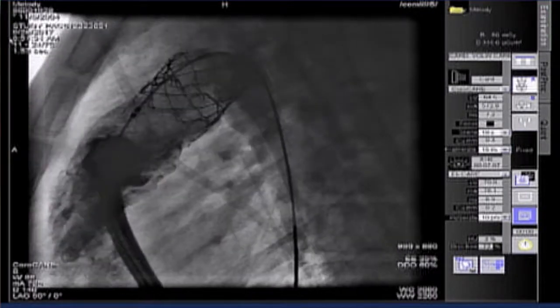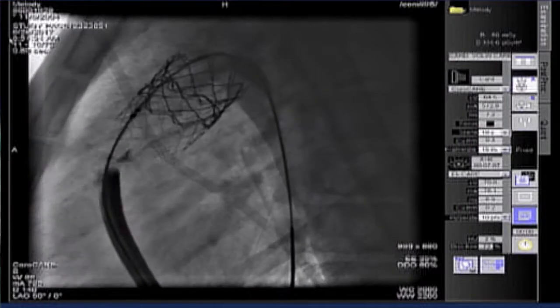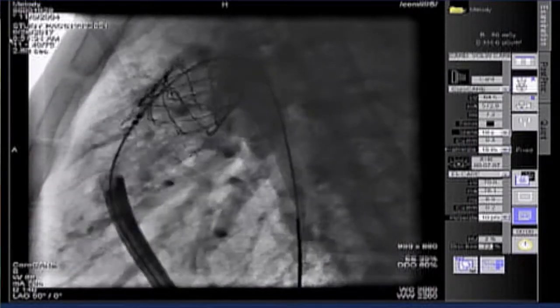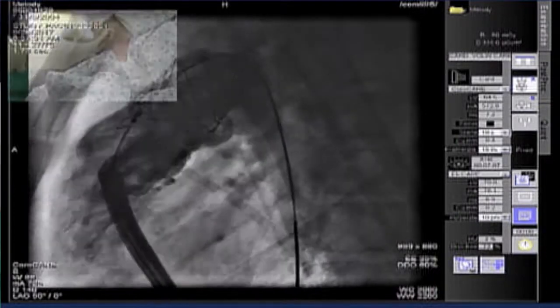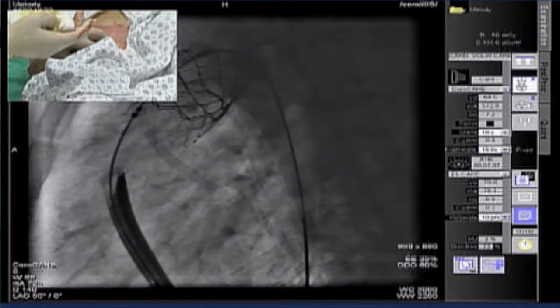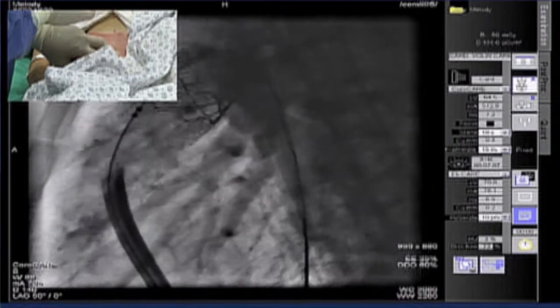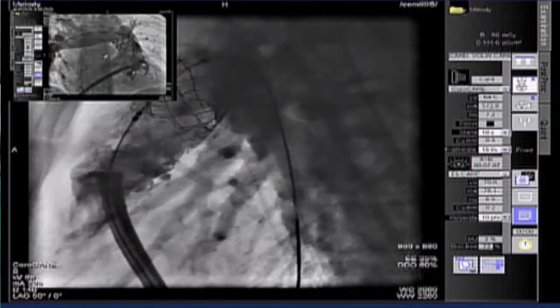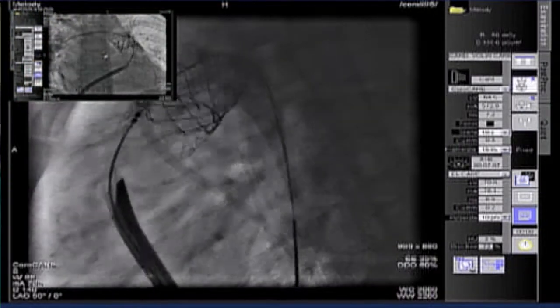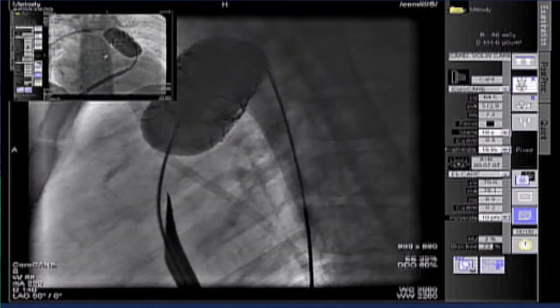But if you look, can you give also the AP? Yeah, you see at the left inner the AP. Or both, but especially look at the frontal. The frontal, I mean, it's the cranial. It shows that the left inner curve is not completely opposed. So I did reinflate. Can you make the frontal bigger?